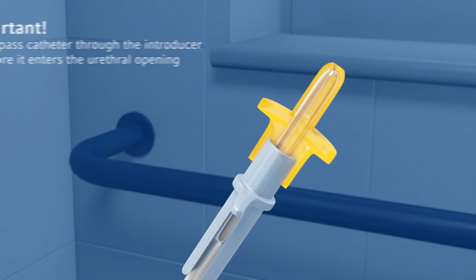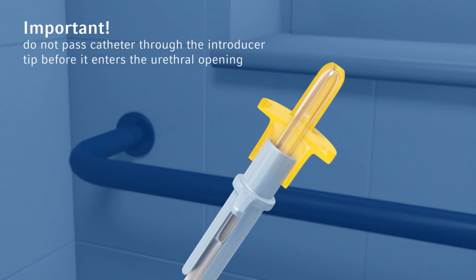The introducer tip is one of the main features of the MMG closed system for helping to reduce the risk of urinary tract infection. The introducer tip protects the catheter, allowing it to bypass the first 1.5 centimeters inside the urethra where the majority of the bacteria reside. Therefore, it is very important that the introducer tip is inserted into the urethra the full 1.5 centimeters before you start advancing the catheter.